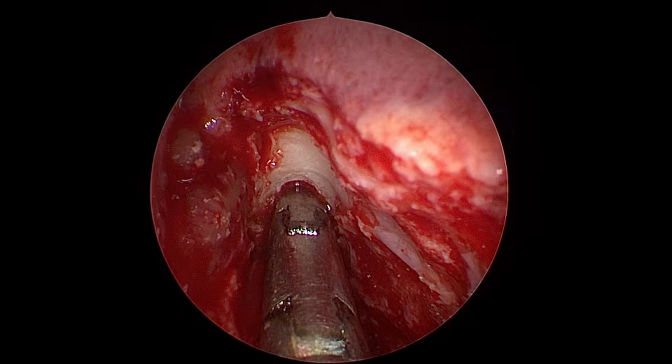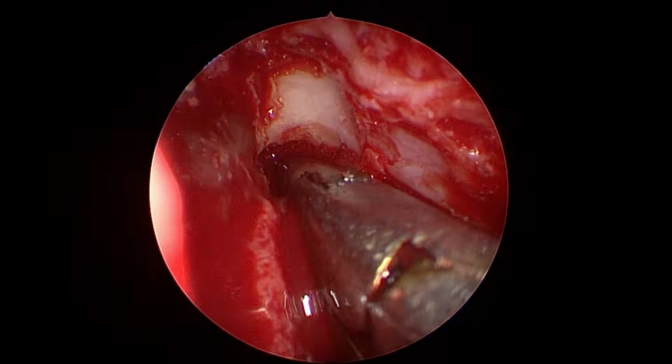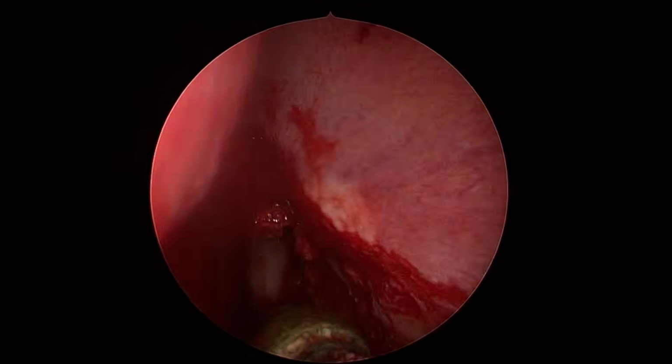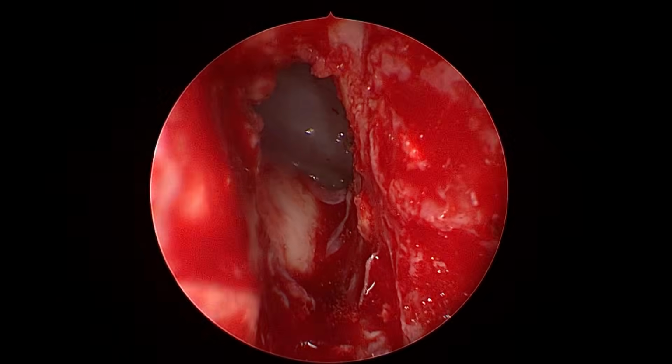See now? I think the bone punch is a better instrument at this place. If the bone is too thick, you can use a drill. So I am not removing the entire floor. I am just removing the overhanging beak.